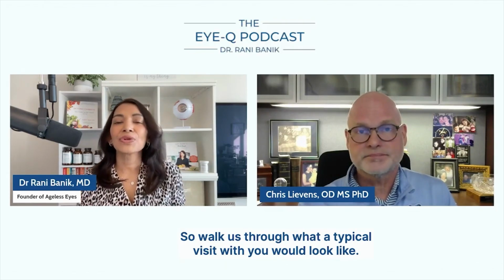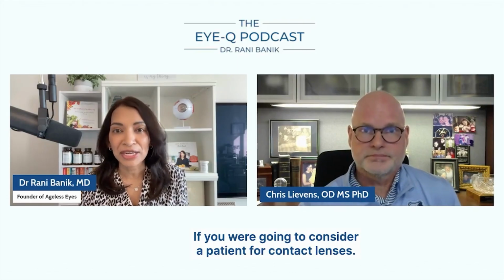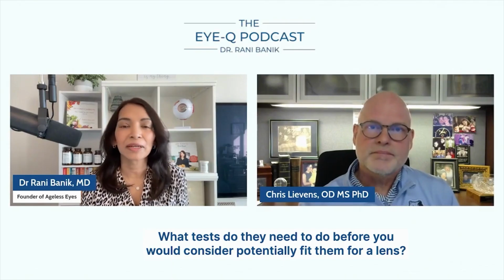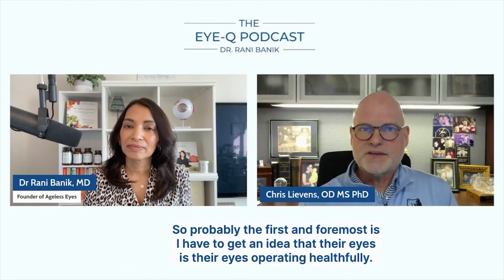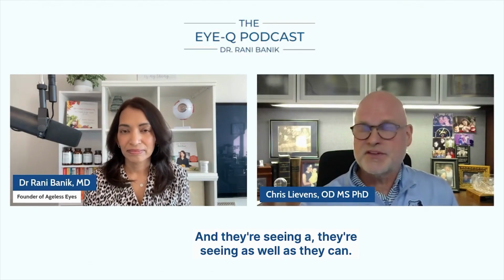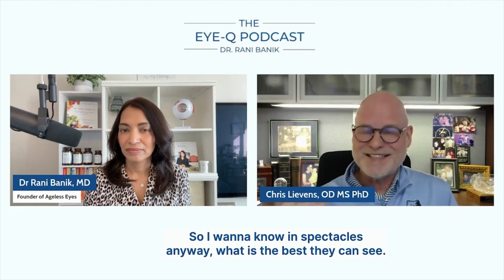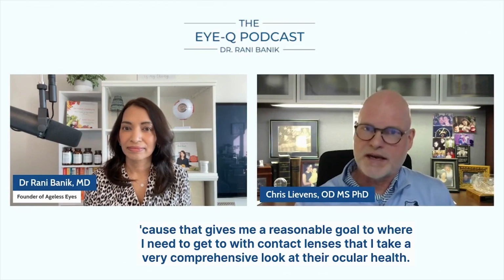So, walk us through what a typical visit with you would look like if you were going to consider a patient for contact lenses. What tests do they need to do before you would consider potentially fitting them for a lens? So probably the first and foremost is I have to get an idea that their eye is operating healthfully and they're seeing as well as they can. So I want to know, in spectacles anyway, what is the best they can see, because that gives me a reasonable goal to where I need to get to with contact lenses.